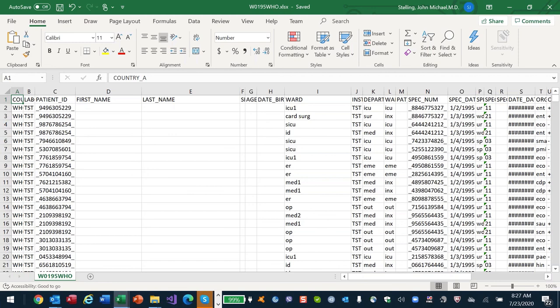Okay. I never even thought of actually using CSV as an option for WHONET as a data structure. It's not a modern structure, which is why we never supported it, but DBase has been used for 20 years. We had a few problems with DBase in the last few years, and then it started to grow in February, and for the last 2 months, we've just been having a lot of issues. I do think it's because Microsoft did some automatic update.